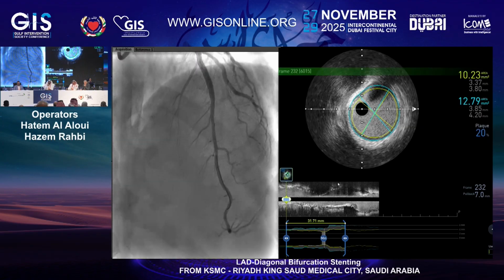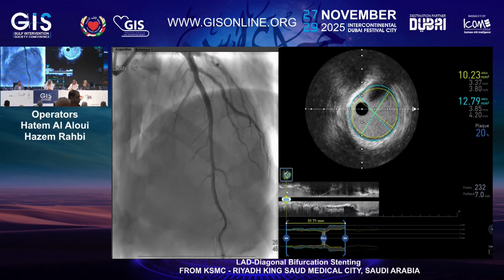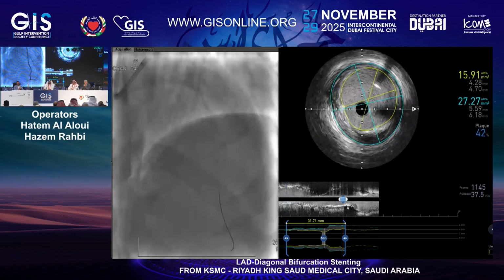Dr. Hatem, how much contrast did you use? How much now? 110, I think. 100. Okay, 100. That's good.